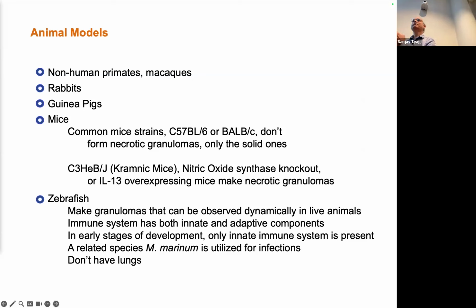It was hard to see the lung, right? Because the liver is not. No, yeah, that's right. You probably can't image the lung while keeping the animal healthy. But I think this has this unique feature that you can initiate at time zero and observe rapidly. That kind of experiment is feasible here. It's different than lung, but I believe this is because it's injected in blood. Yeah.